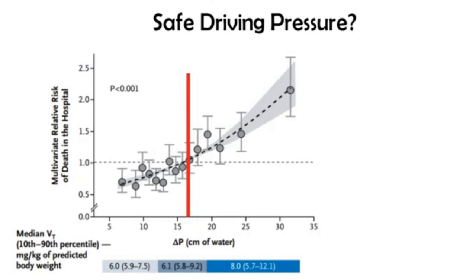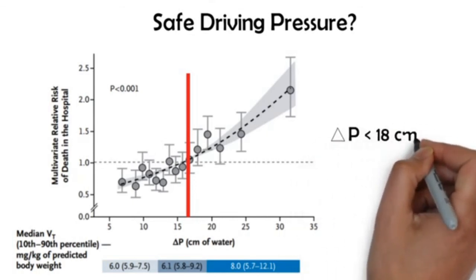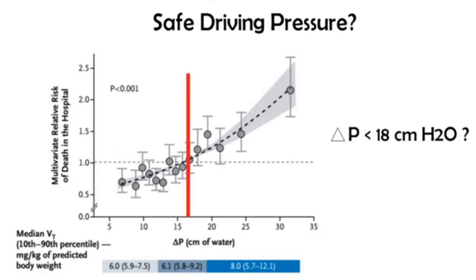A more recent study by Villar et al. suggests that a driving pressure of up to 18 centimeters of water may be safe.